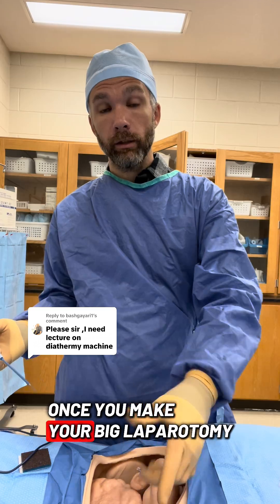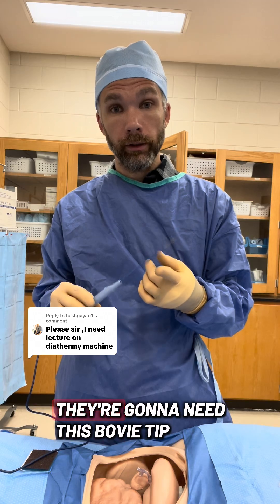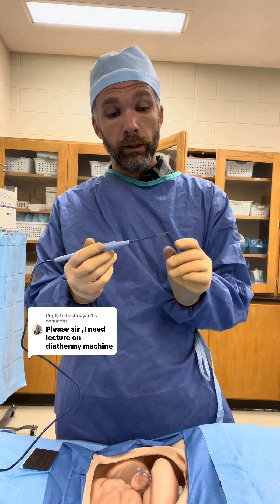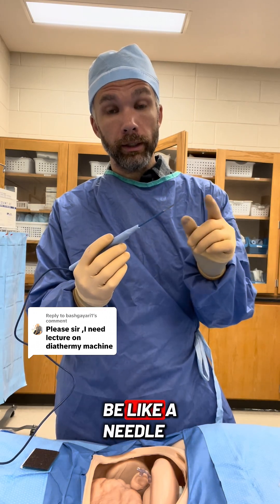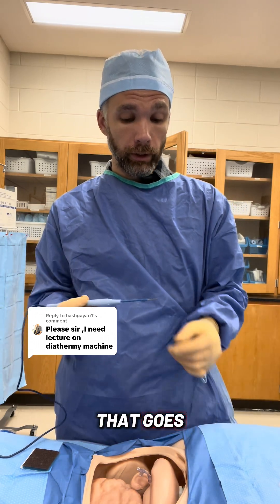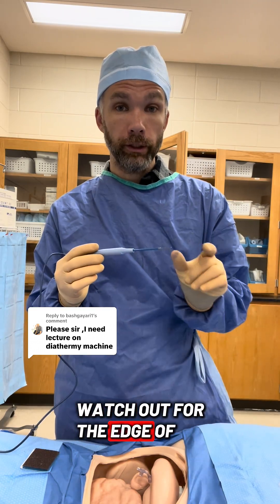Once you make your big laparotomy incision, if you're doing an open case, start thinking about whether or not they're going to need this Bovie tip. They also come in needle point — the end of this Bovie will be like a needle and it will poke you, so make sure you're careful with where that goes. They can be short or longer. Watch out for the edges; they're very sharp.